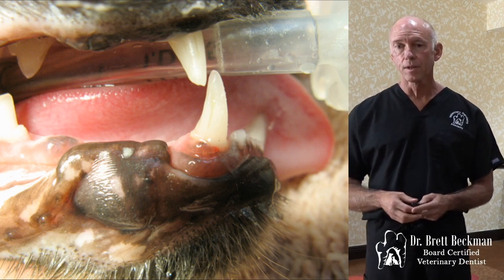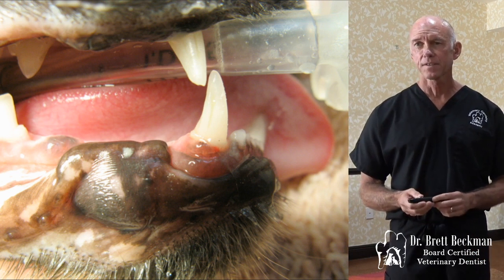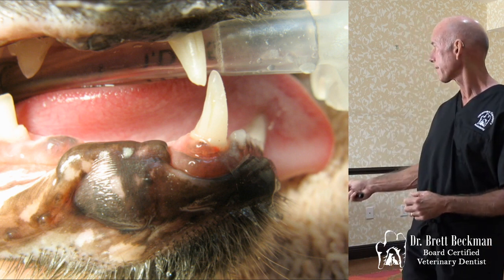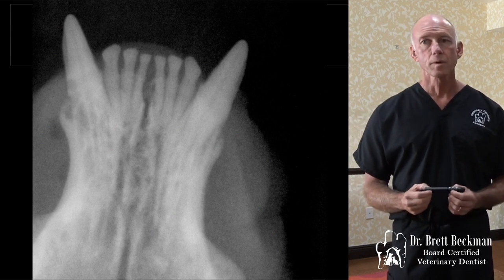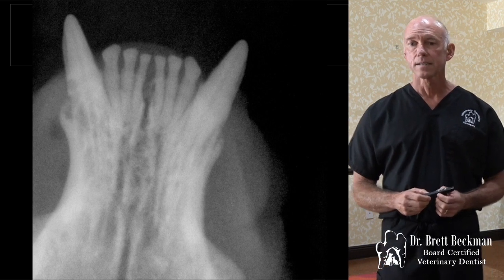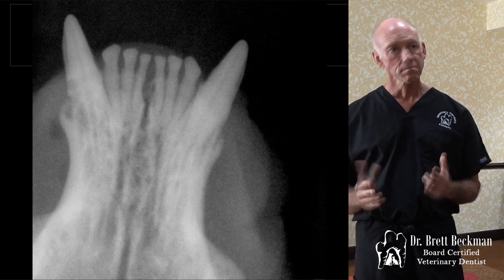Here's one that has a little lesion there, just starting on the mesial aspect. Do you guys even see that? It's kind of hard to see. It's right there. But total type 2 resorption with those striation effects. So that would be more like a true crown amputation.